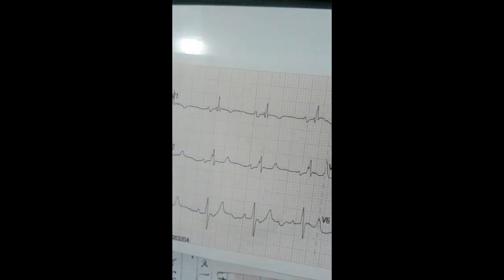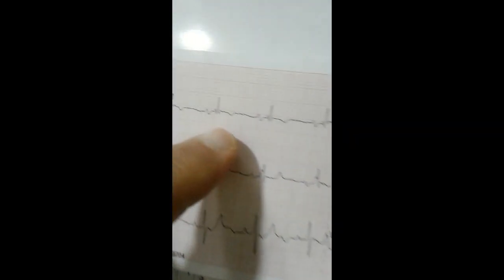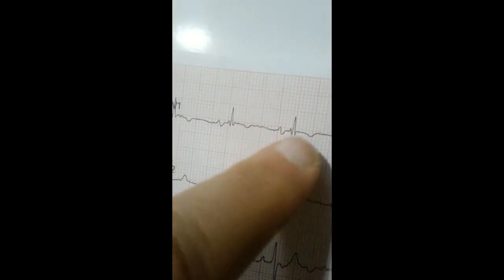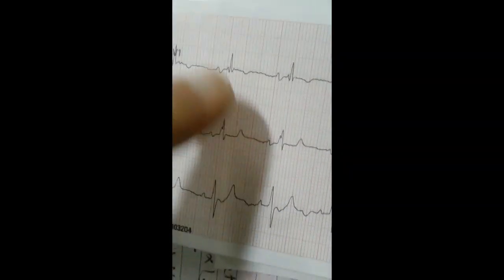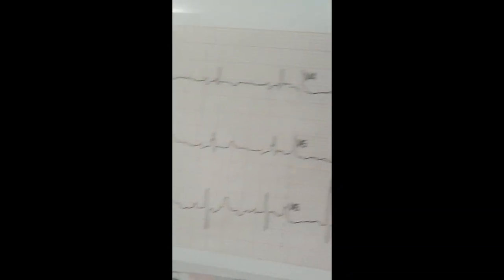On ECG, she has sinus rhythm with normal axis, but the R-wave is present in V1. This R-wave in V1 is similar to that of posterior myocardial infarction.